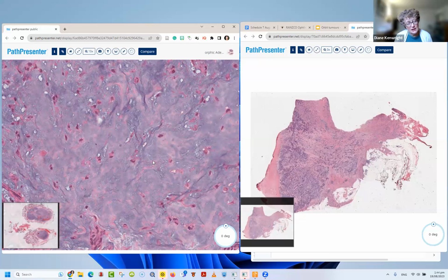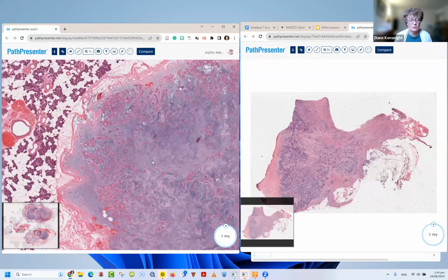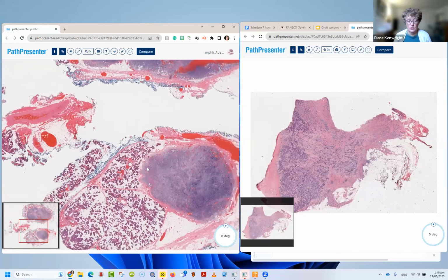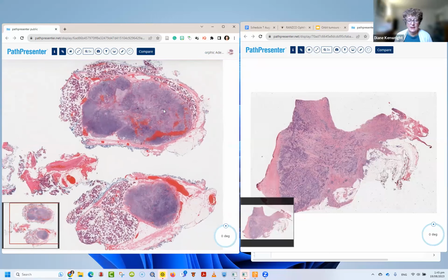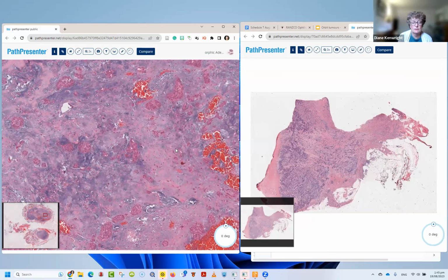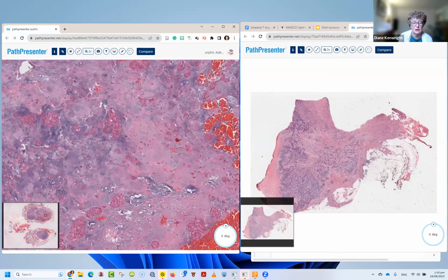And often in the 5 questions, you ask for the normal, the abnormal, which we've just described, a pleomorphic adenoma with myxoid stroma and benign ducts, and the prognostic factors. So this is benign, so it has a good prognosis, but the prognostic factors are that it is completely excised and that there's no evidence of atypia, mitoses, or malignancy, because very occasionally, only like textbook rarity, you can sometimes get tumors arising in these, which are adenocarcinomas, mostly if they're left behind and are there a very, very long time.